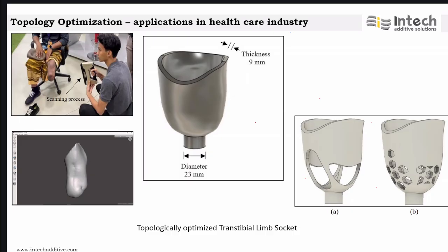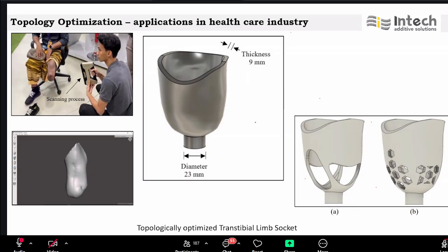Thank you, sir. This is new information for us also. And another question from Dr. K. Gobi Saravanan, our center head. He is asking which kind of lattice structure will give better mechanical properties?